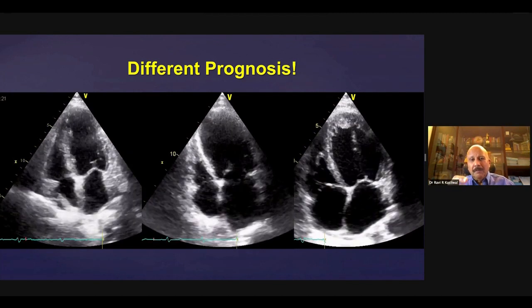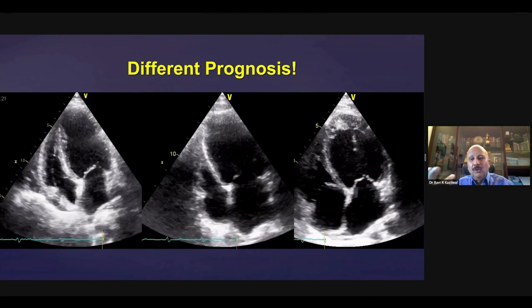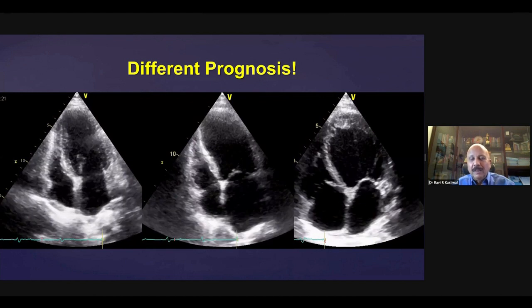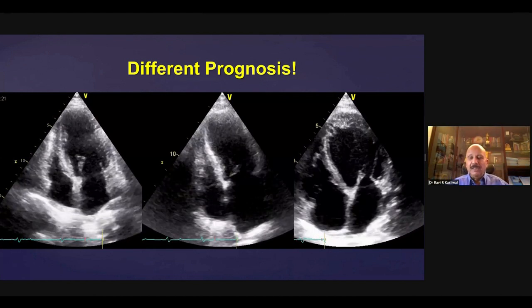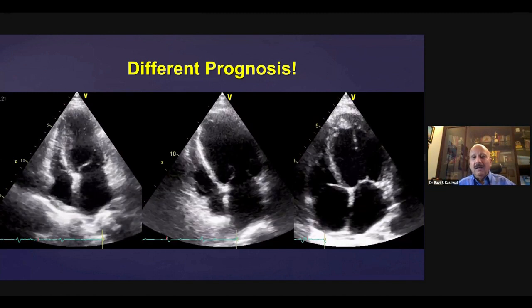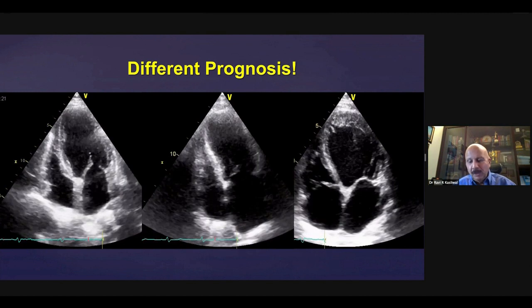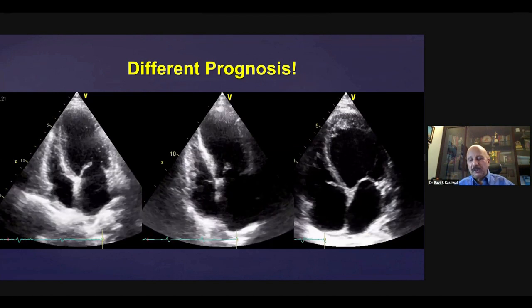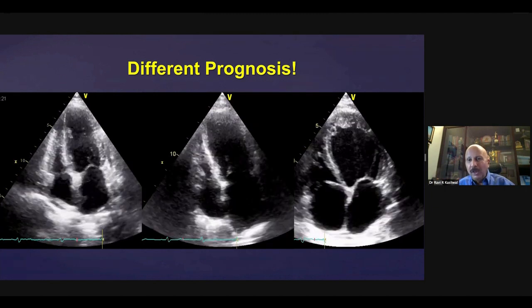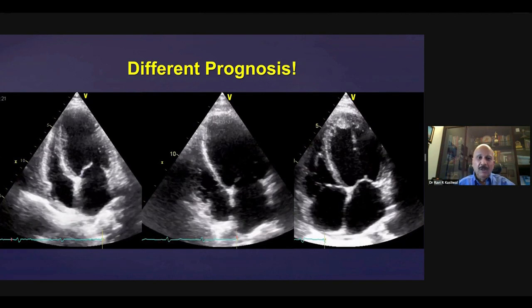Also, many times patients have ventricular arrhythmias and the ejection fraction is on the lower side. We do know that how EF taken over a period of time can help you with your electrophysiology colleague, that should you be giving this patient an ICD implantation. So all this decision making in coronary artery disease particularly, of course they can be used in cardiomyopathies as well, but in the context of coronary artery disease, where a bulk of our patients come from, you can really make a big difference to this patient just by doing a good ejection fraction study, looking at PA pressures, looking at TR jets, looking at IVCs, and prognosticating these patients.